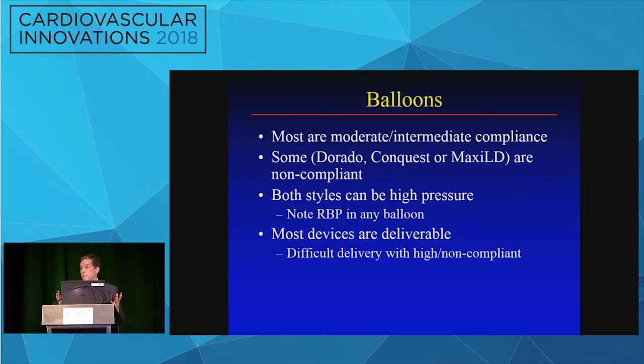What they have is differential expansion. You have to remember that there's resistance to expansion, and then there's least resistance to expansion. And where the balloon will expand or grow is in that least resisted area. And so you'll get differential expansion, which leads to dissections and potentially perforations.